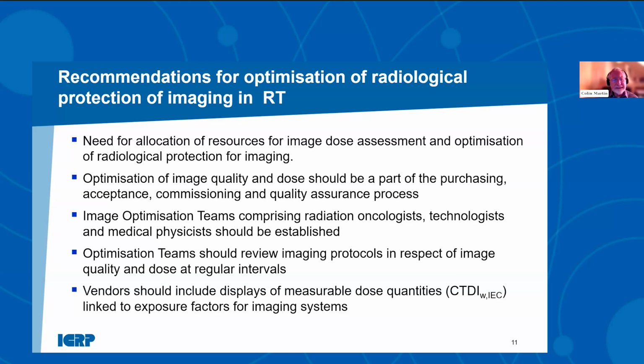Another recommendation I'll mention is that we recommend that vendors should include displays of the measurable dose quantities. So there's a CTDI, which is quite complex to measure, but has been agreed by the International Electrotechnical Commission. If we have a display of that linked to the exposure factors for imaging systems, then that could be used for patient dose surveys in the future.